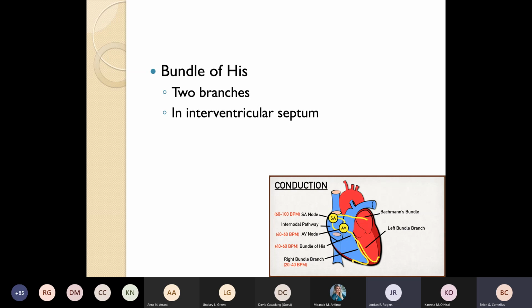This, especially when we start talking about our 12-lead EKGs, becomes kind of a big deal, because you might start to see bundle branch blocks or conduction delays in either the left or the right bundle branch. When that occurs, instead of seeing one easy QRS complex, you may actually see different ventricular depolarizations, because that delay or bundle branch block has created a timing inefficiency where you're able to see maybe the right side before the left side, or vice versa. Don't worry about that so much for this lecture. When we get into the 12 leads, I'm going to show you an easy way to figure out whether it's a right bundle branch block or left bundle branch block.